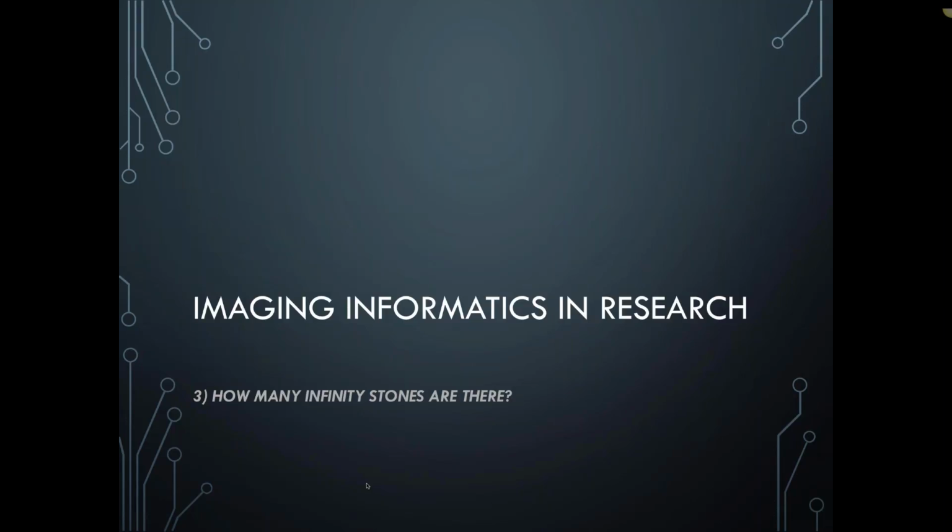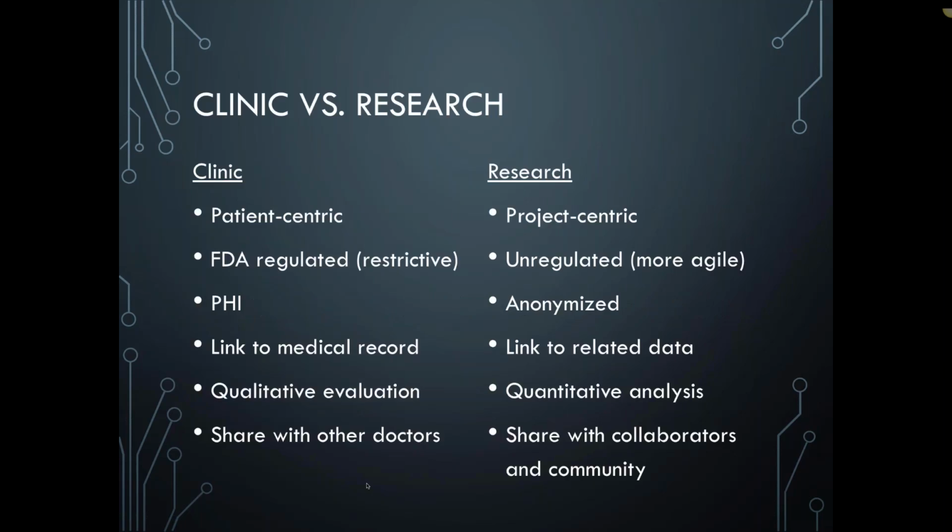But I'm going to switch now to imaging informatics tools that we use really explicitly in research that have DICOM capabilities and know how to talk to the clinical infrastructure, but are really more focused on research types of operations.